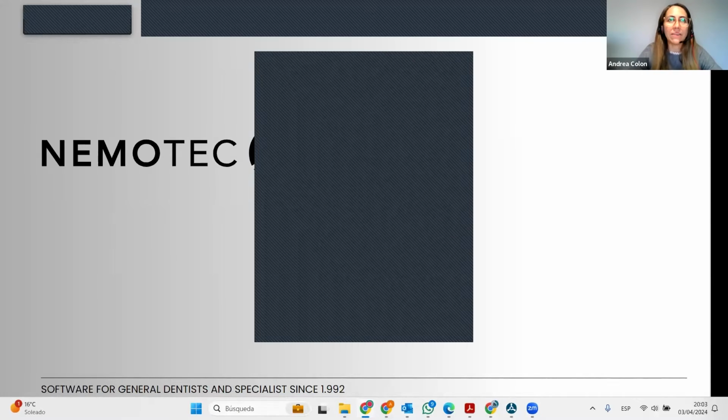I have been working at Nemotec almost 6 years, very involved in all the digital workflows, design, and development of the software. We also have a planning center where we receive many of our clients who request our planning services.